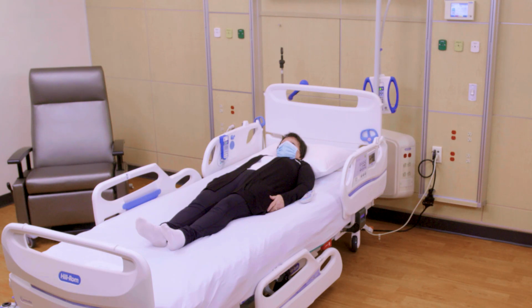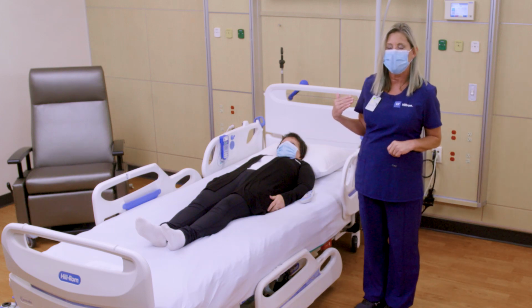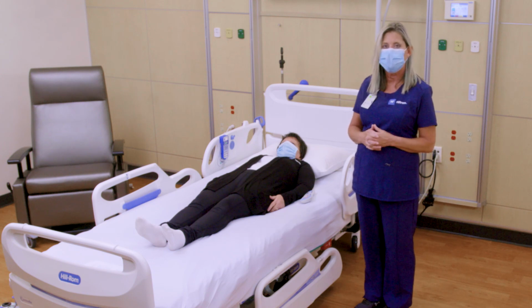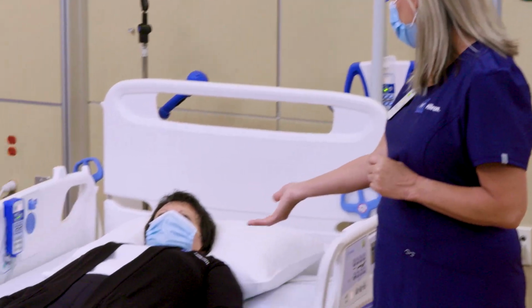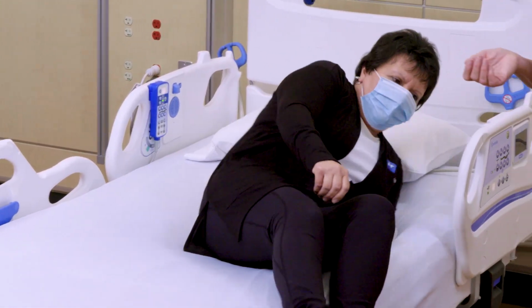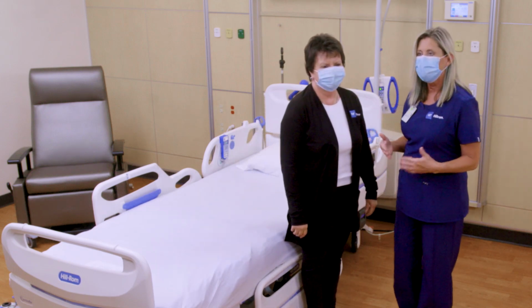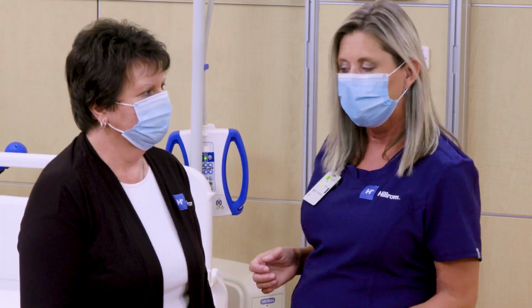So our next scenario is interaction with the patient, allowing for not only automation but suppression of all alarms. Upon entering the room, I can interact with the patient wearing my staff locating badge and being identified in the room. Navicare Patient Safety allows me to interact with the patient without manual interaction with the bed. Nancy, can I help you get out of bed? With my presence in the room and my staff locating, I can interact with the patient without any alarms.